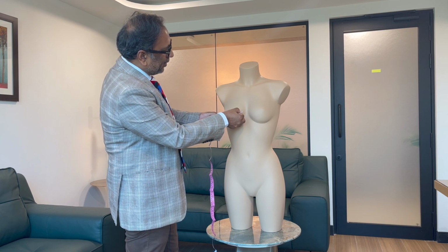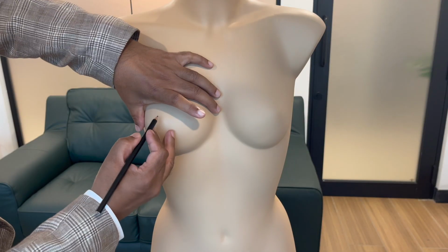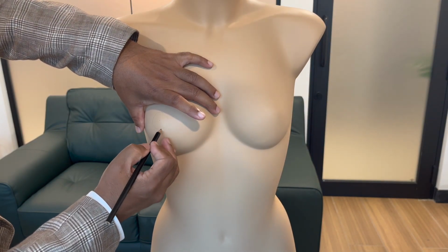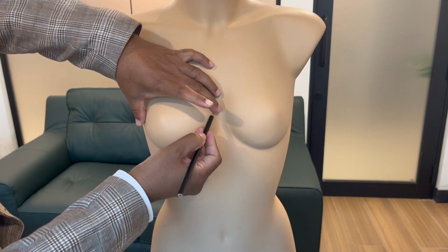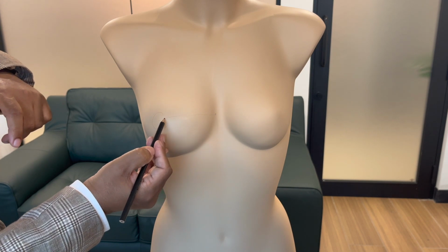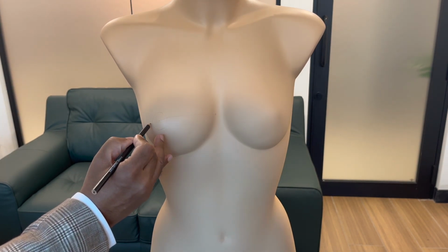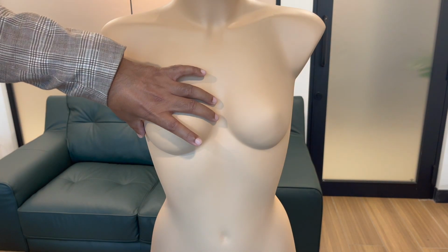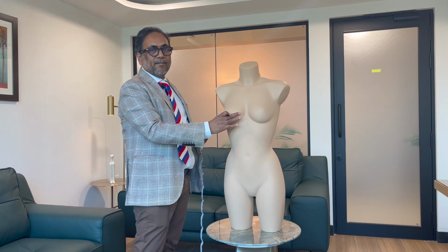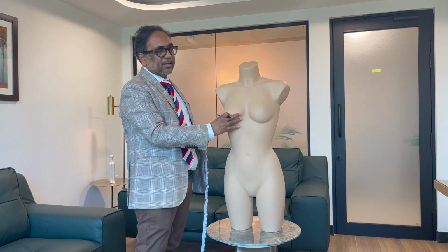In this particular case, it's around 13.5. So let's say this is the position of the nipple areola, and that's the line along which we measure the base width. Wherever the breast is starting to lift off from here and where it is beginning to end over here, that's the base width, and this determines the width of the implant. And this is the most important measurement which will actually determine what kind of implant the patient is going to have.